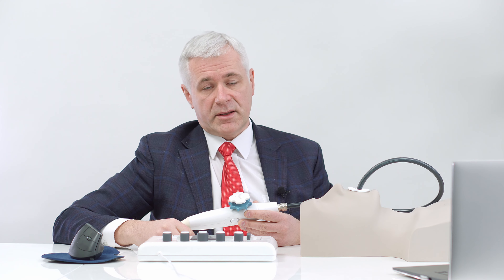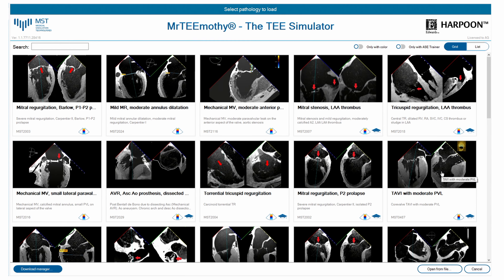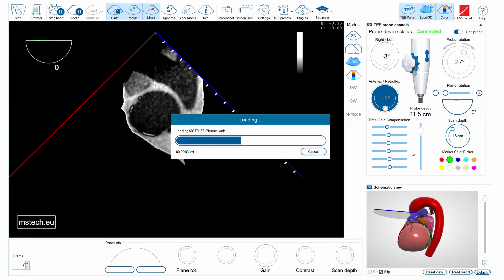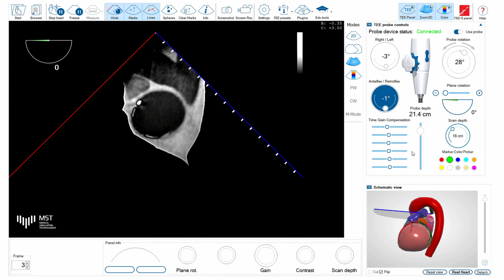Let's select another patient from the Timothy library. Here is the case after implantation of an aortic valve — a TAVI valve.